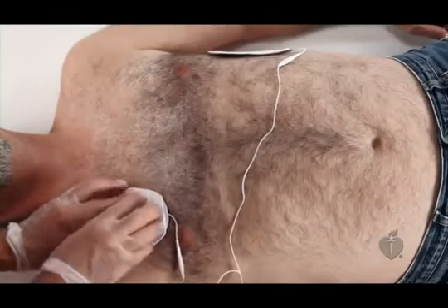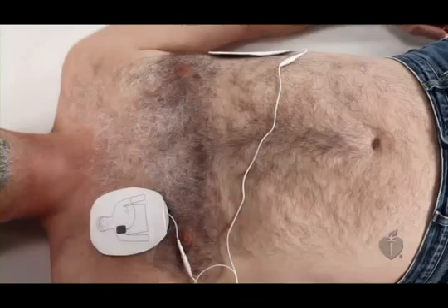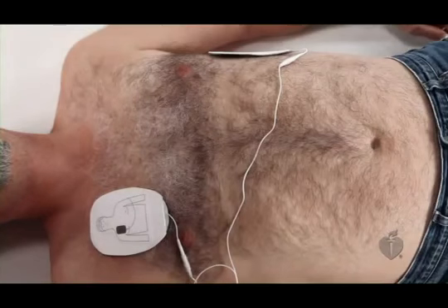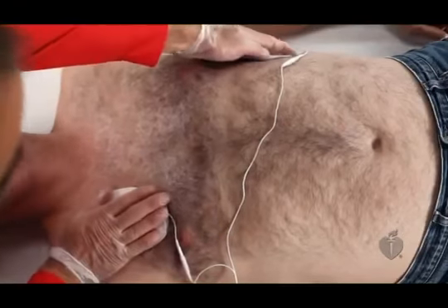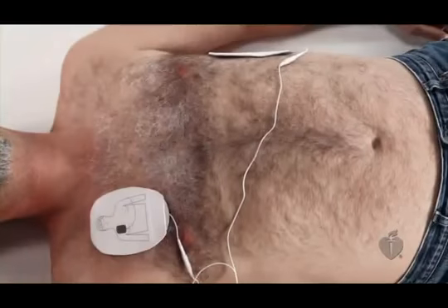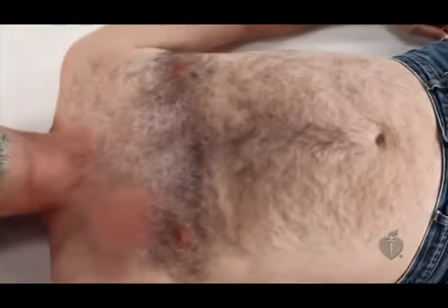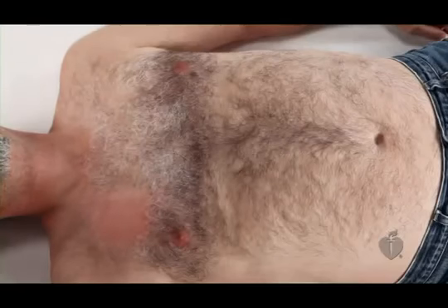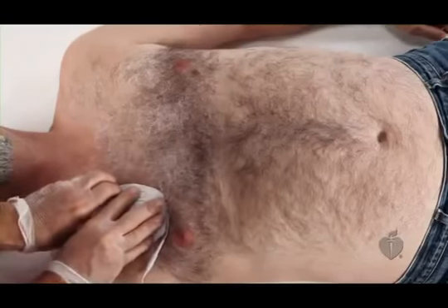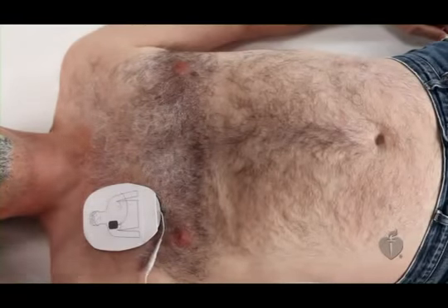If a victim has hair on his chest, the hair may prevent the pads from sticking. The AED may tell you to check the pads. If this happens, press the pads down more firmly. If they still aren't sticking, rip the pads off forcefully, removing the chest hair. Then reapply a new set of pads to the bare skin. If your AED supply kit has a razor, you can use this to shave the area as well, and then reapply a new set of pads.